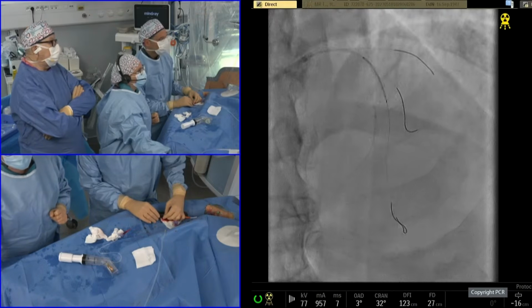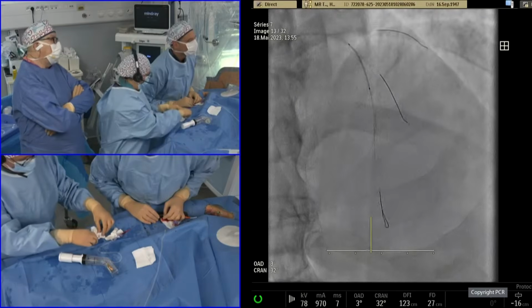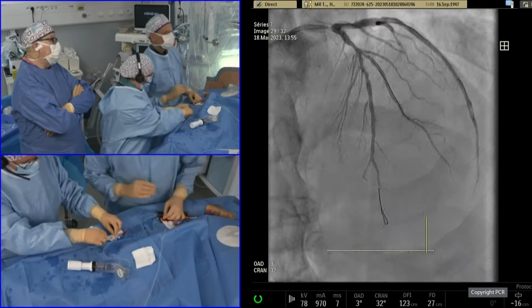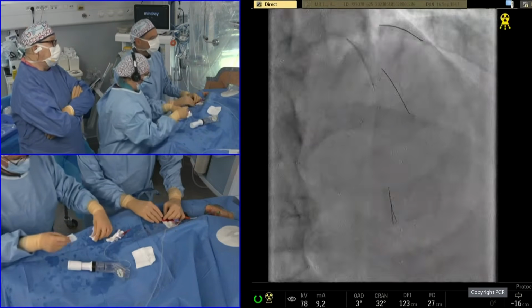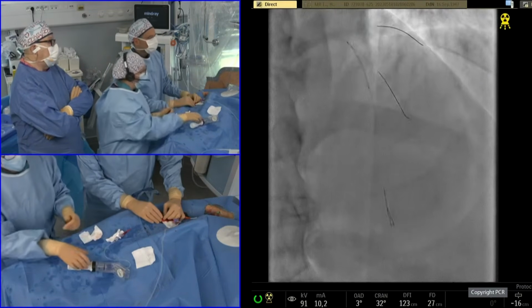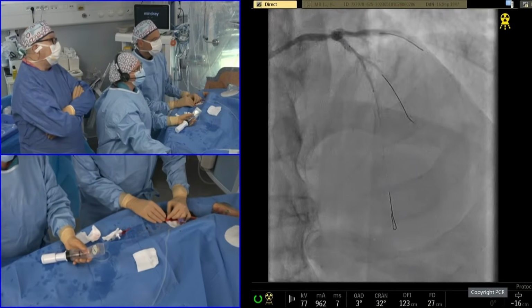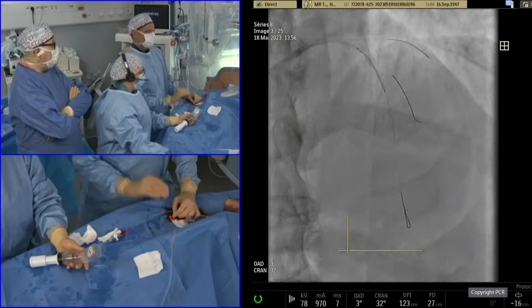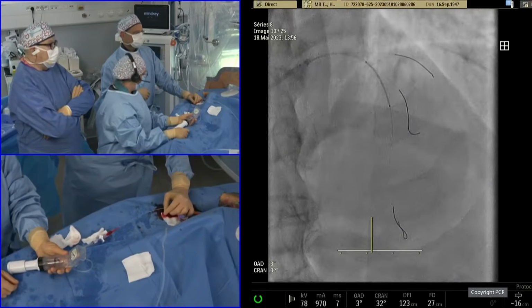Yoshi's shown us as well that the Ultimaster technology has evolved. So we've gone from the small vessel to large vessel to now small, medium, and large. Historically, the small vessel was able to go up to 4.2. We now have this medium vessel technology that can go to 4.8 millimeter, and the large vessel will go to 6.2. So that issue around tapering vessel, we can overcome.